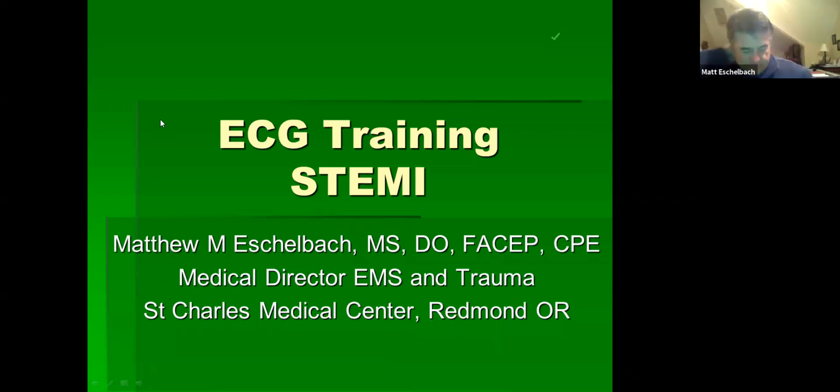All right. Welcome, everybody. So tonight we're going to talk about EKG training, particularly STEMI, and we'll go through one step at a time, and then a very systematic approach to attacking an EKG so that we understand how to read it and define the area that a STEMI may be occurring.